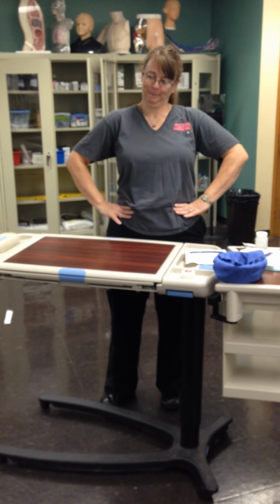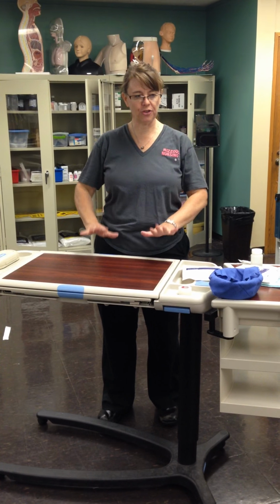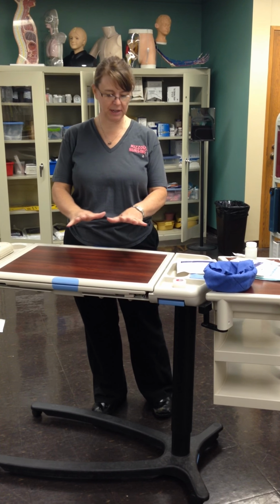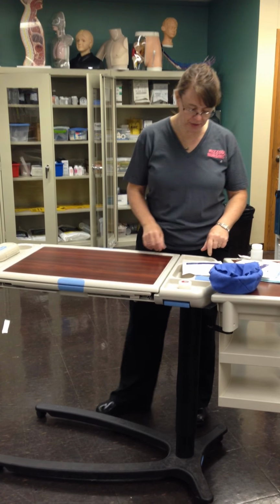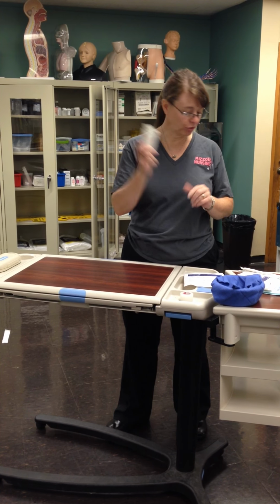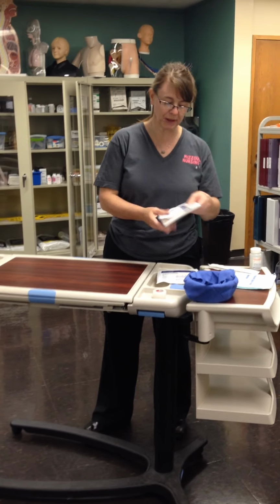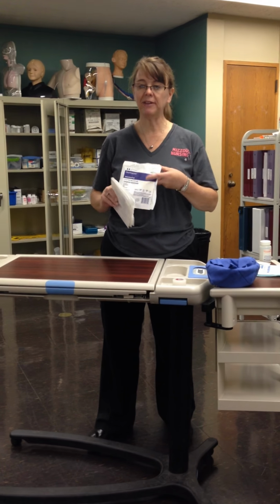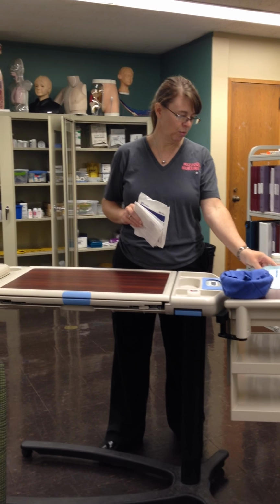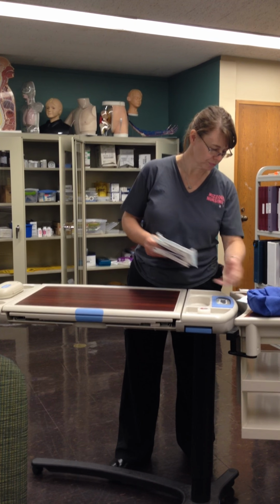Hands on her hips. I'm going to make sure that this is about waist high, because if it's too high or too low, it's going to affect my ability to get it set up. So you guys in your packets have the majority of this stuff. We have our solution, some Q-tips, gauze sponges, an ABD pad, a sterile field, and a bowl.